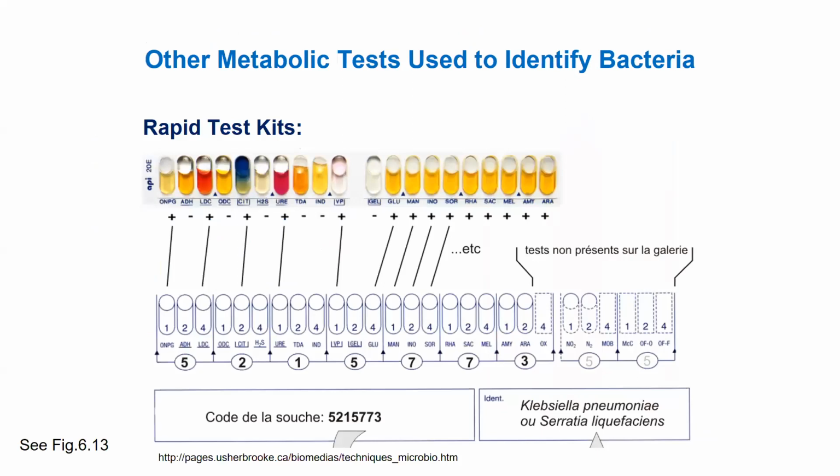There's at least a few companies that specialize in these kits. There's one called BioMérieux, I think it's called. They're a French company, and they have thousands of these test kits. One of the things that this company specializes in is this little plastic plate. You can't really tell very well from the photo.